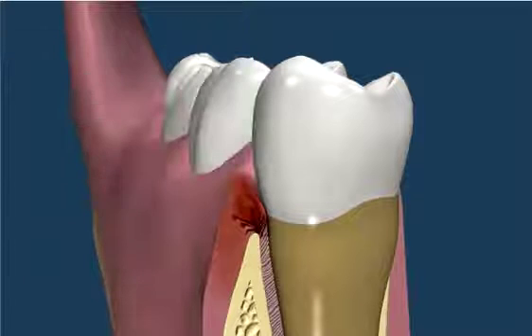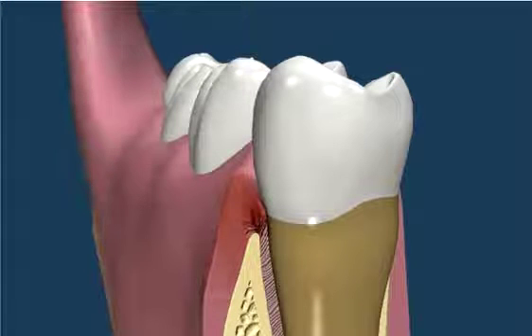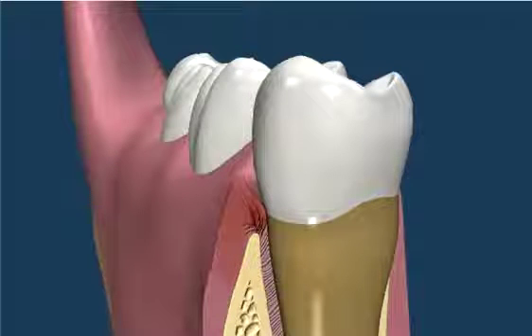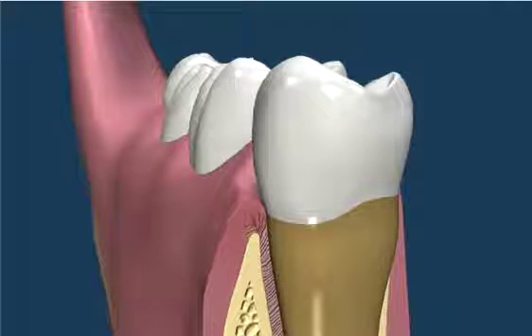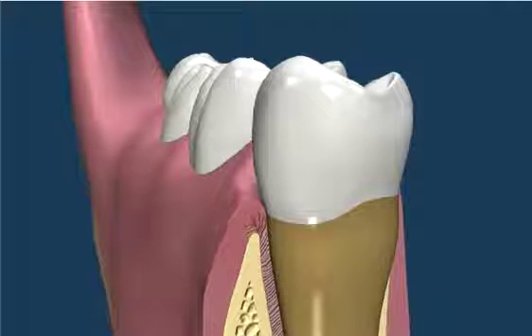Without the tartar there acting as an irritant to the tissues, the gums will revert back to their healthy state.